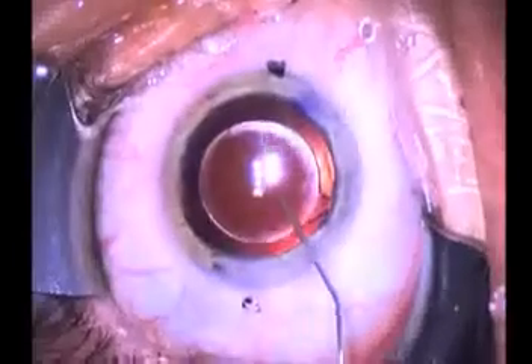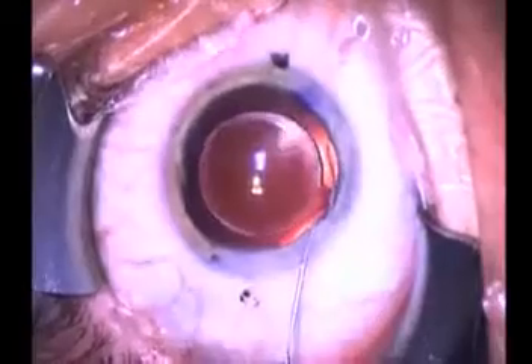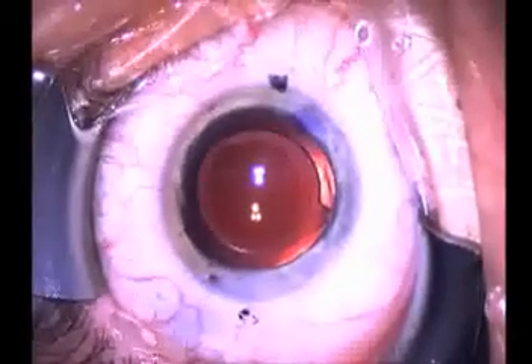Once we have the lens in proper position, we push gently back on the lens to seat it in position. And you will see at the end of the case a nice alignment.